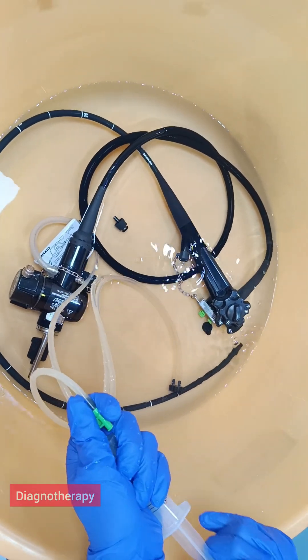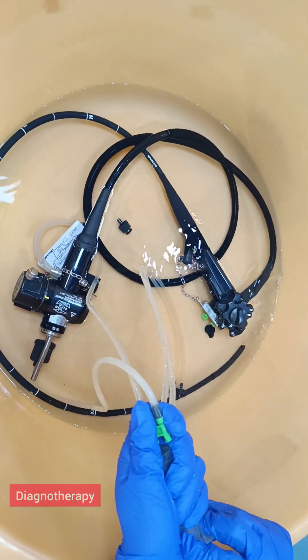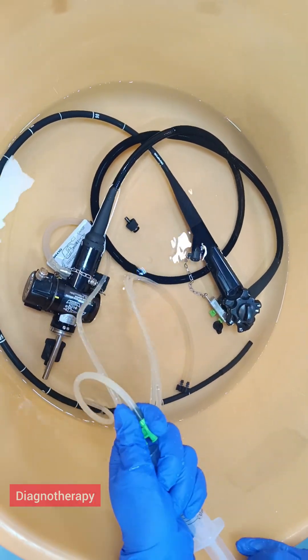In both tubes — both ends of the tubes — you can see the green tube, and in that we need to attach the syringe and we need to suck and flush.